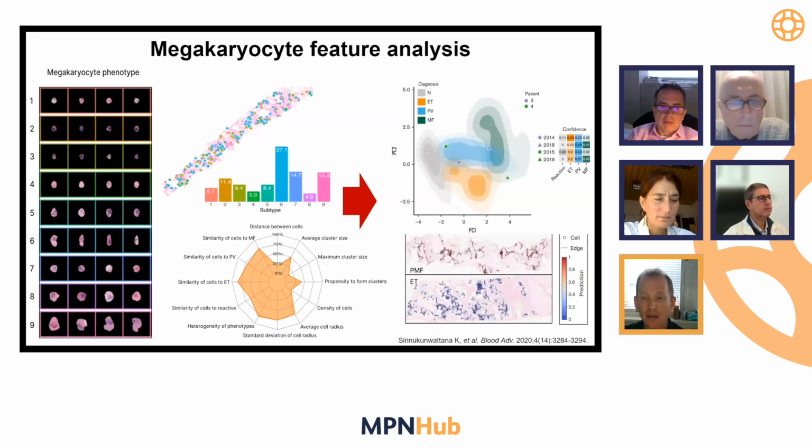So, very briefly to outline, the very first work we did was looking at megakaryocyte morphology in MPN. We know these are important features diagnostically used by pathologists. And we built a machine learning model, an algorithm that could work on a routinely prepared scanned slide of a marrow. We trained the model to spot megakaryocytes, to extract them from the image, and then we could begin to describe in a systematic way the morphological features of megakaryocytes, but also their clustering, their topological distribution in the marrow. And this was our first attempt, on the top right, to begin to describe so-called disease space.